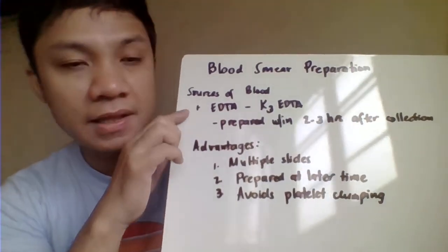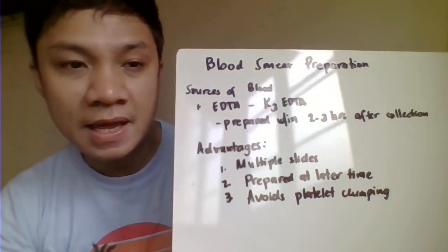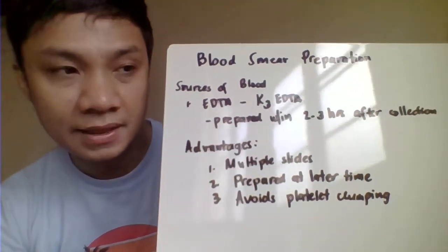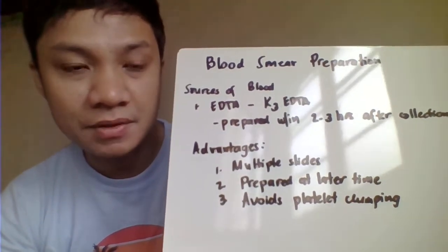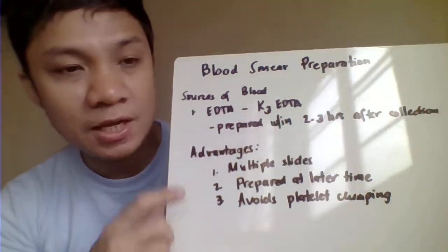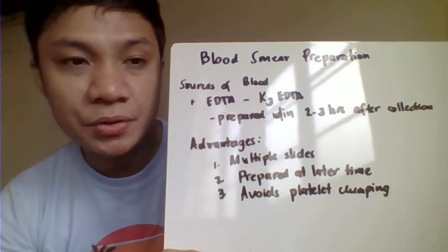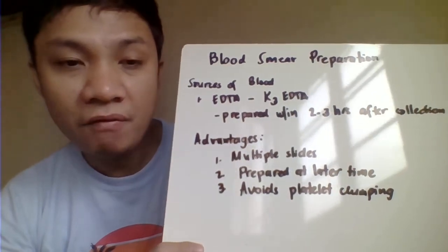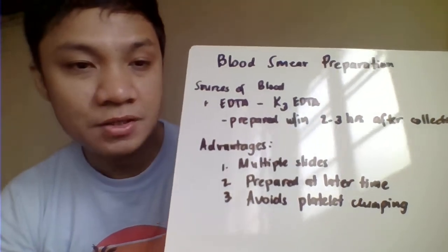The first one we have here is anticoagulated blood. The ideal anticoagulant for blood film or blood smear preparation would be blood collected in EDTA. Basically, that is tri-potassium EDTA, because that is the one recommended here, the liquid tri-potassium EDTA. Ideally we can use blood collected in EDTA for blood smear preparation, provided that you prepare your blood film or blood smear within 2 to 3 hours of the collection process.